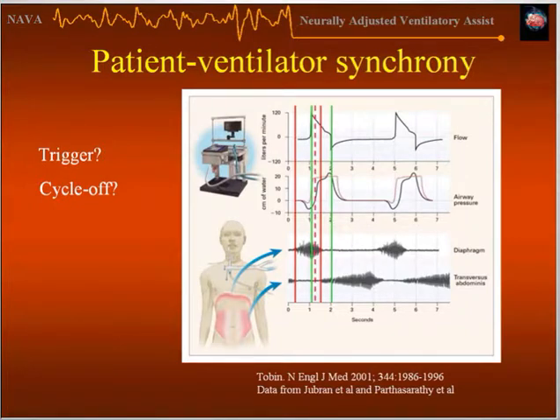We know from physiology that the dashed line is a representation of where the actual inspiratory flow would stop. If we now look at synchrony, we could see that the overlapping area between the open red line and the green line here is very small. If we look at where we would anticipate inspiratory flow from the patient and when the ventilator is actually delivering flow, the overlap is extremely small. This, as pointed out by Parthasarathy, results in increased expiratory muscle activation, and the patient is fighting the ventilator.